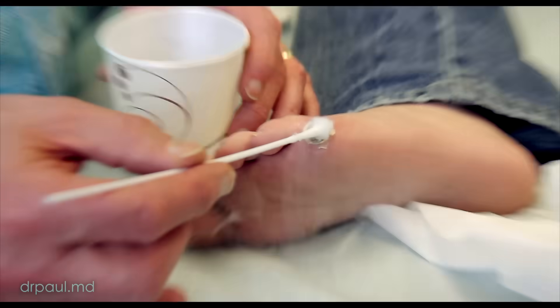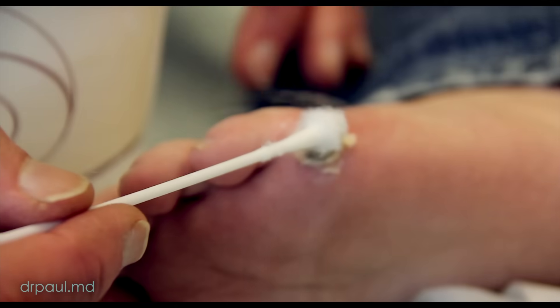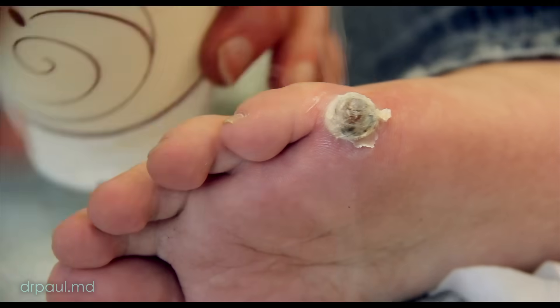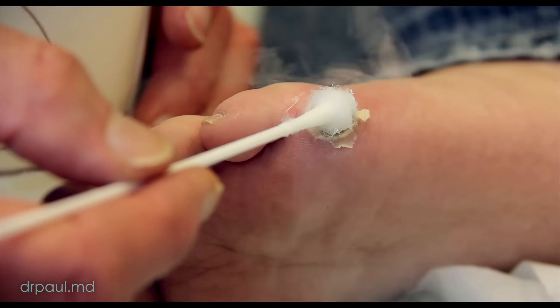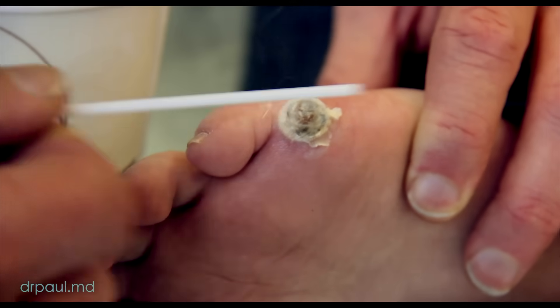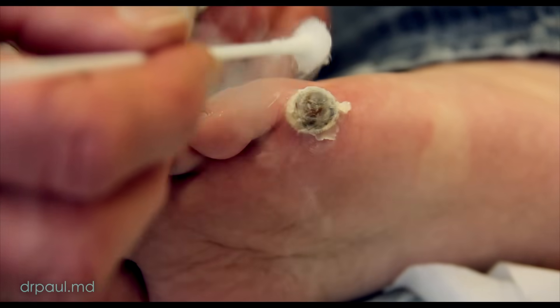You can start to see we're getting about a millimeter rim of white frozen normal tissue, and that's usually your goal because some of these warts go a little bit deep into your skin. We're trying to freeze right down to — some people call it the root of the wart — so we're getting that little rim of freezing. You're doing really well.